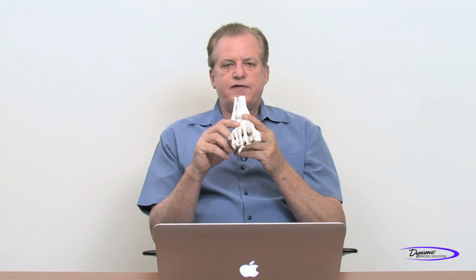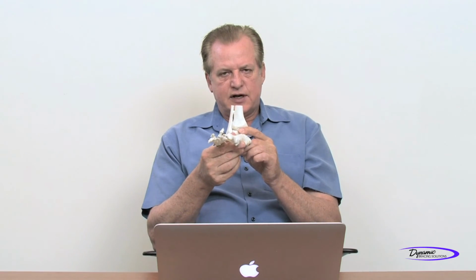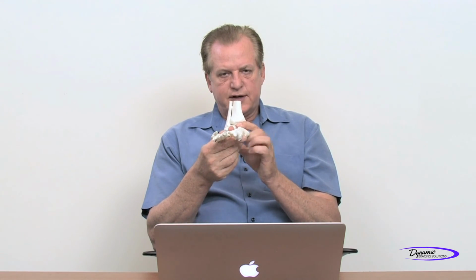The other is what I have found: when we do accommodative orthotics, that means that we cast in whatever position the foot is when the person arrives, this actually adds more force and actually less comfort. Day one, it feels good because it's formed to them, but there's nothing to prevent that limb from further collapse. And then we keep blowing out, like say around the navicular or whatever, and then it becomes uncomfortable and we have to keep heating up. And what it does is it allows the deformity to continue.